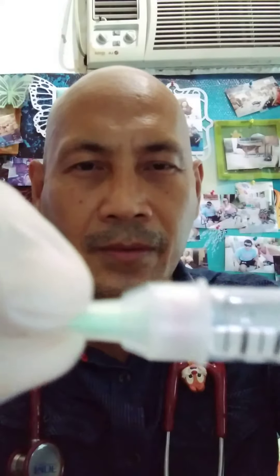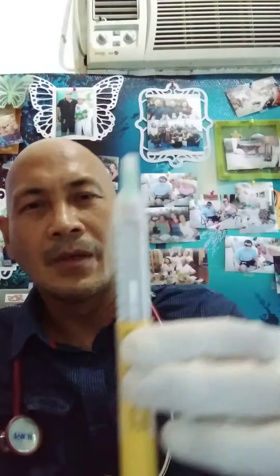You have to open this one and remove the seal because it is sealed. Then you do it this way and then twist to secure it tightly. This is now how to put your new insulin needle to your insulin pre-filled syringe.